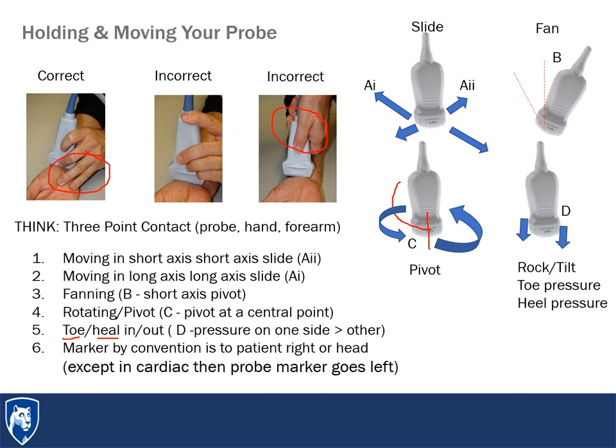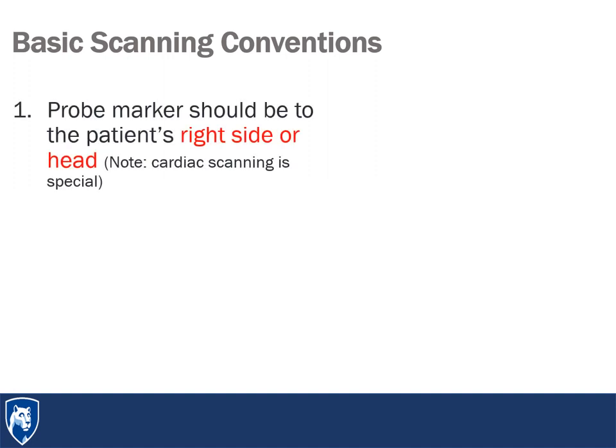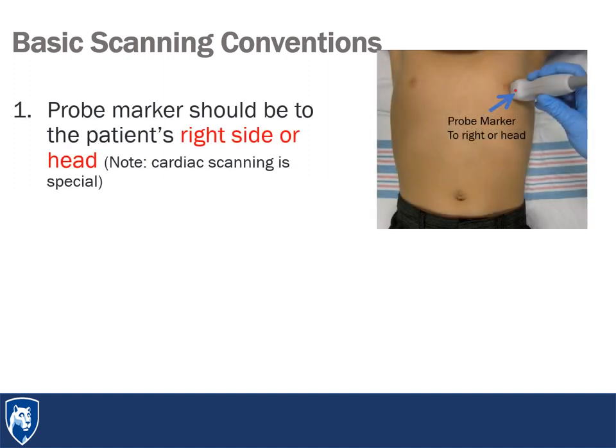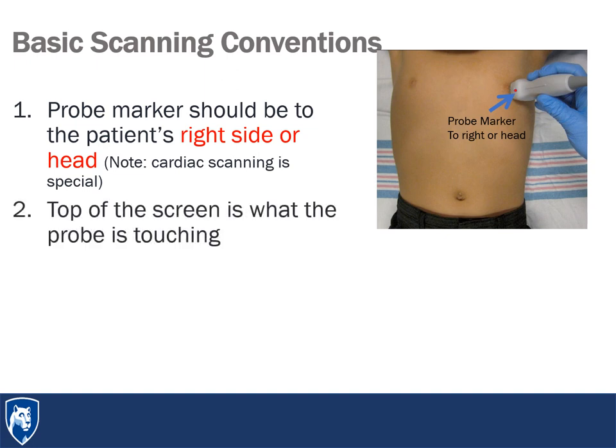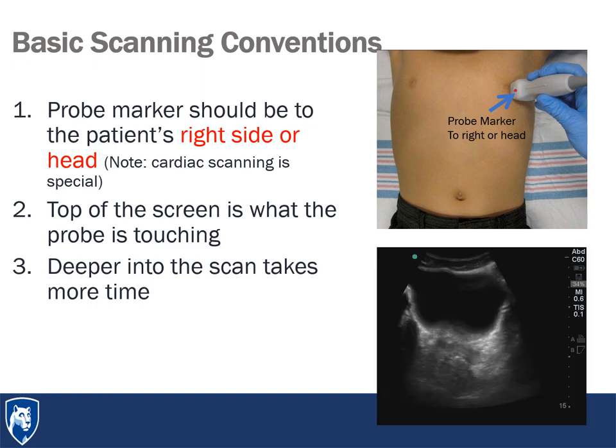And then by convention, we're going to start thinking about the fact that that probe marker, whatever side it's on, should be to the patient's right or towards the patient's head. And we'll think about some basic scanning conventions as well. So probe marker to the patient's right or towards their head. The top of the screen image is what the probe is closest to, and then the deeper into the screen is where the images are.